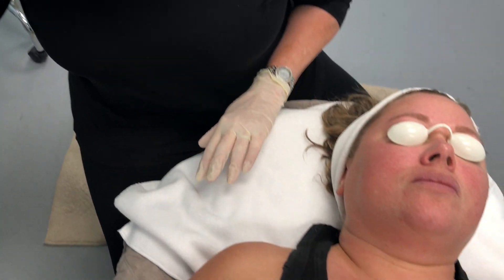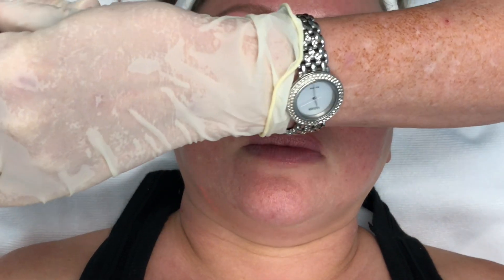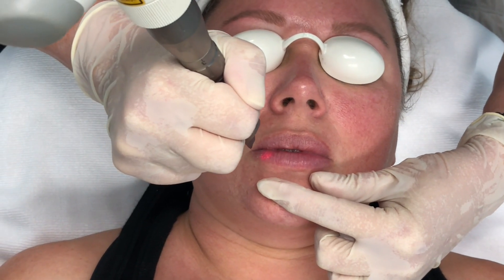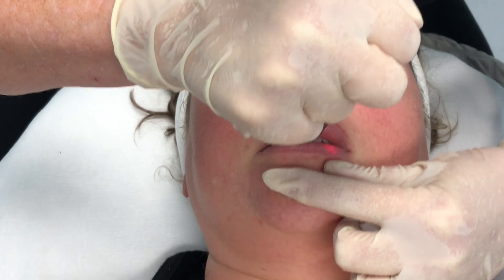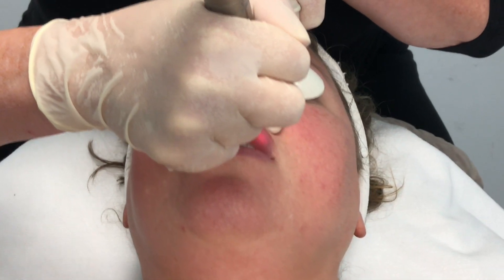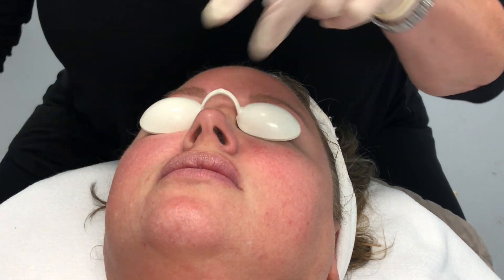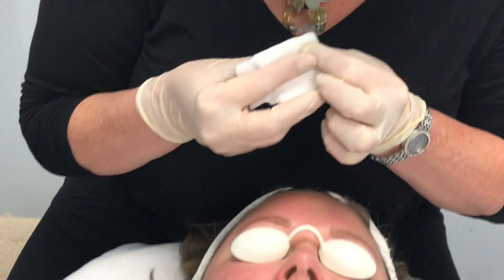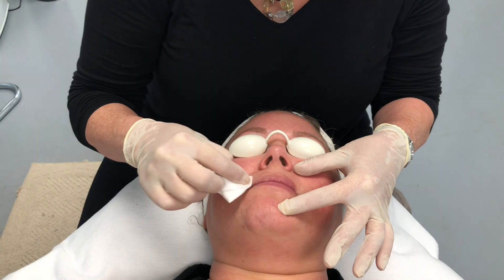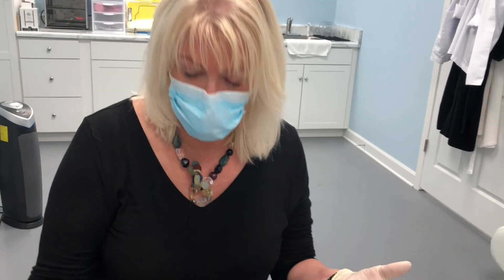I'm going to turn it down just a little bit and treat the outside of the lips. Turn it down and you can put this to a five to six millimeter spot to fit the lip better. This is great exfoliation — it helps smooth the outer lip surface and build collagen. You'll see a beautiful tint come into their lips; it looks like their perfect natural lip tint when you're done with the full three passes. That will be a very nice lip treatment.